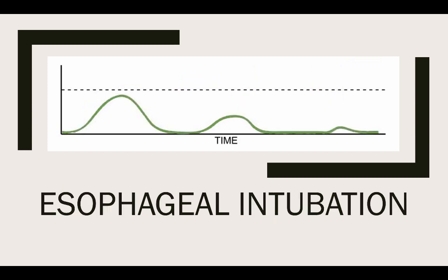The worst of our nightmares is an esophageal intubation. So we think we've intubated the trachea, and maybe we haven't, right? Did I hear lung sounds? Did I not? I don't know. Did I hear epigastric sounds? Did I not? I don't know. Let's hook them up to capnography.